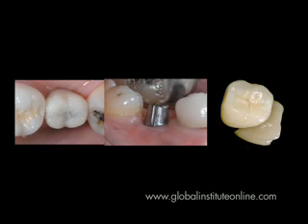These photos demonstrate the preparation of the titanium of the Noble Direct, and of particular interest here is the vertical groove which was placed on the buccal to resist any kind of rotation of the crown on the titanium. On the right photo, you'll see the demonstration already of the final crown which was made by the dental technician. And here on the next photos, you'll see the occlusal position of this crown, which can have a slightly larger occlusal table. Still, I prefer to go with like a more narrow approach on this posterior implant position.